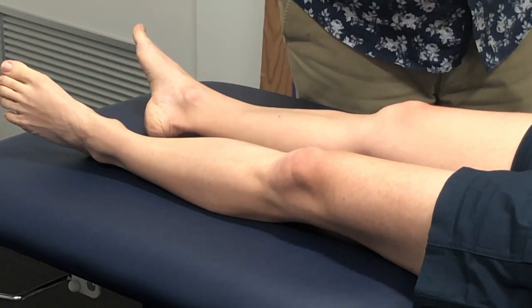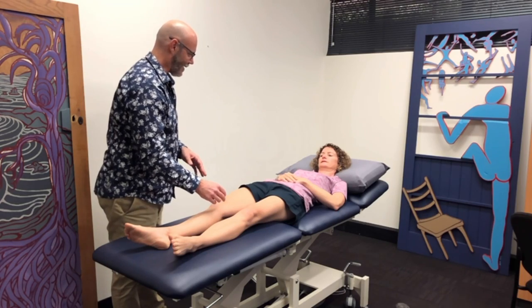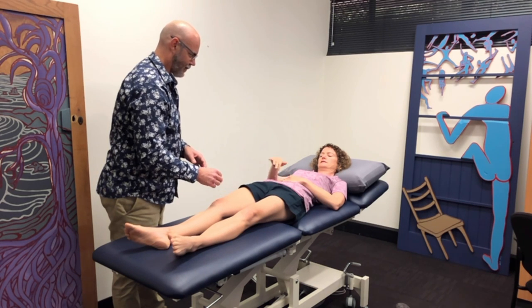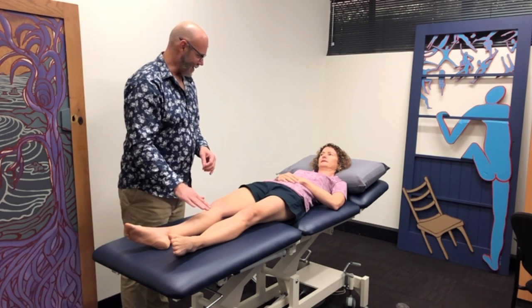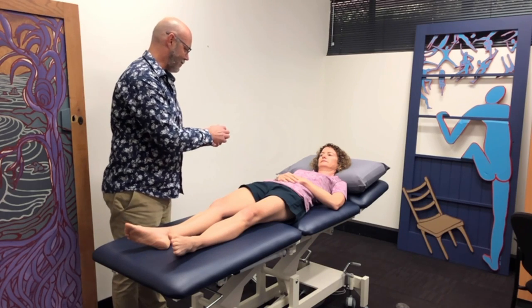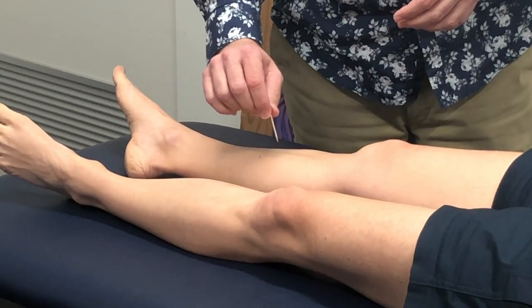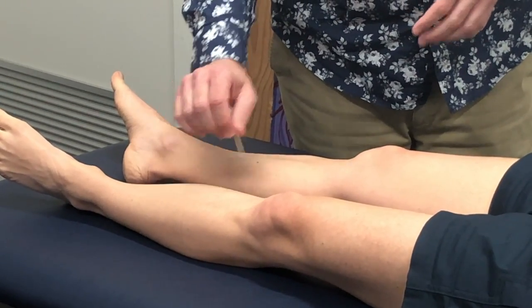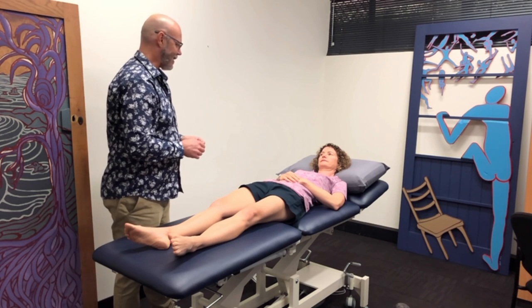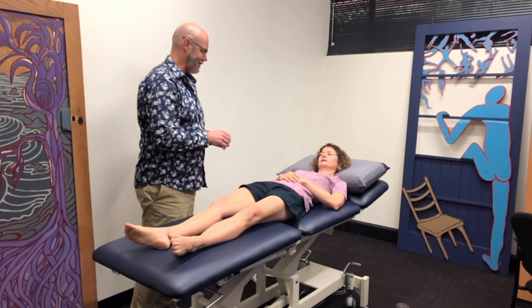That's not good. Yeah? Yeah. So it's different to the other side again? It is, it's different, yeah. And where are you feeling that when I do that? So I can feel it when you're touching, but I can also feel it in that spot where it goes down my leg. Oh, so that's reproducing that pain down your leg. Yeah. And so you would describe that as more painful when I put this on the knee there? Yeah. And lower down? That's not comfortable down there either. So that's different to that side? Does it spread there or is it just where I'm doing that? Just where the two things touching the skin. Okay, so that's a bit like the light touch one that we did as well, isn't it? So a little sensitive? Yeah, that one was worse.